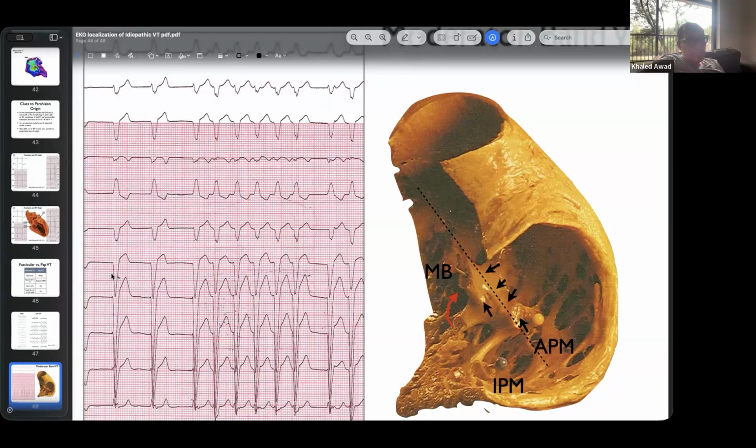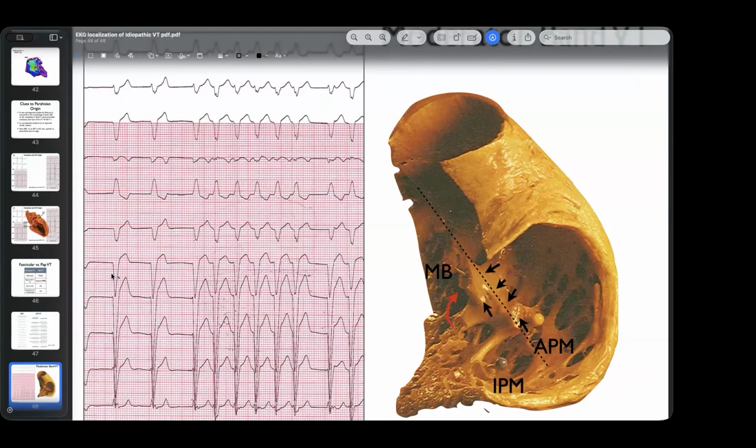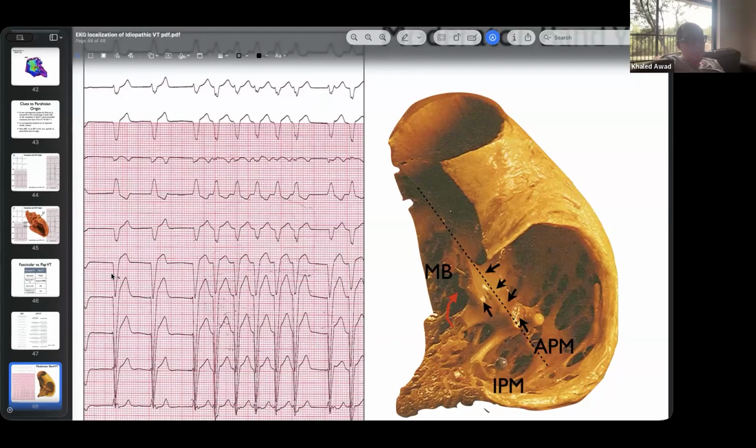Maybe the contact force is not great. In the RVOT in particular, there is the septal side of the RVOT. You have to really bend the catheter a lot to get there, and that's what a sheath helps you do. Again, not going into the RVOT, but sort of by the tricuspid valve, and then you really have to use a lot of deflection on the catheter.